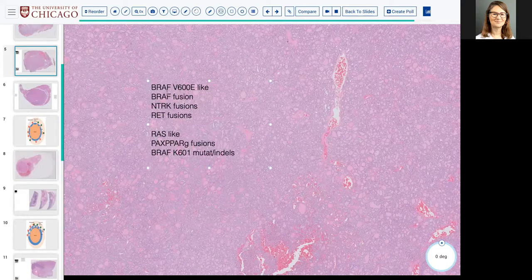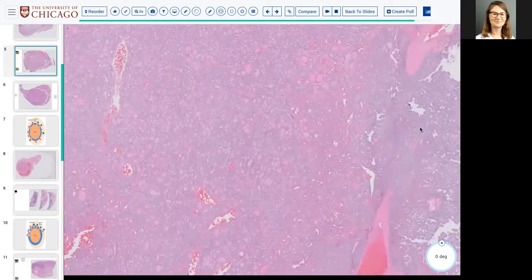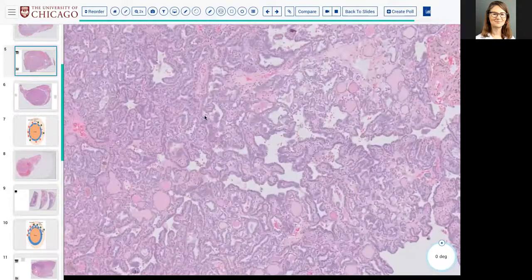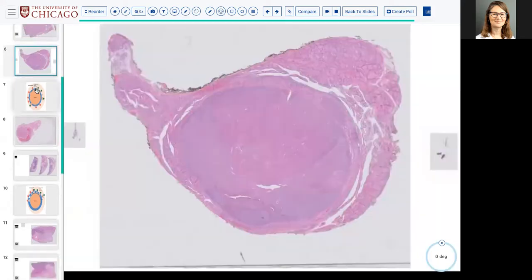So this had a BRAF fusion, so regard this as more of a PTC. All of you who picked up on those features, like the pooching, the invasion, the papillae, were correct in hunting out those morphologic features. Great job. Questions?